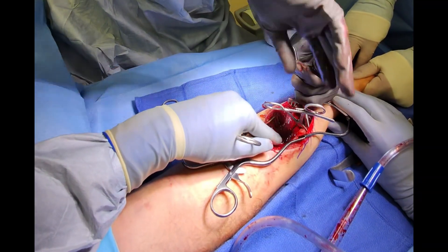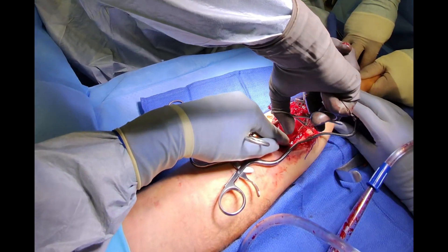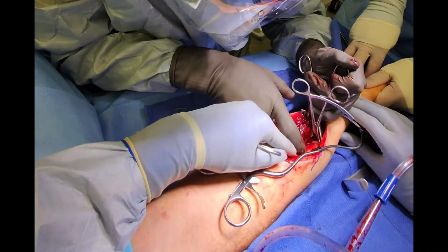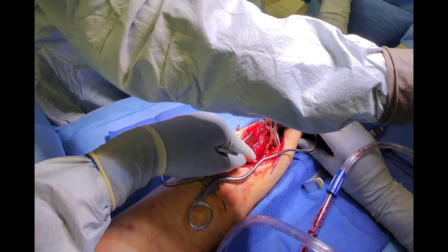Now that the fracture is aligned, we use a bone clamp to secure the positioning and drill to place a lag screw to hold the fractured pieces together. The purpose of the lag screw is to provide compression forces to the bone ends for direct bone healing.